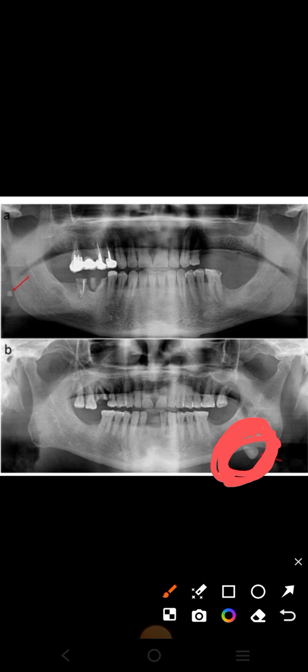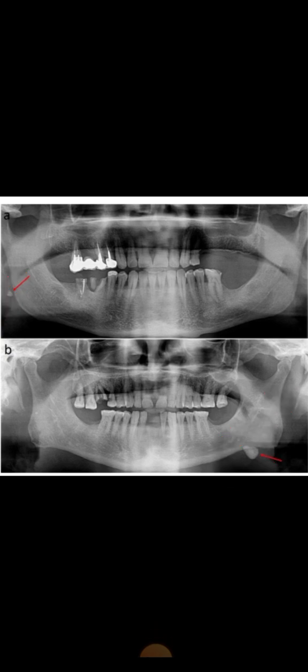On the lateral side the parotid gland is present, so this may be a stone in the duct of the parotid gland. That was all - thank you very much.